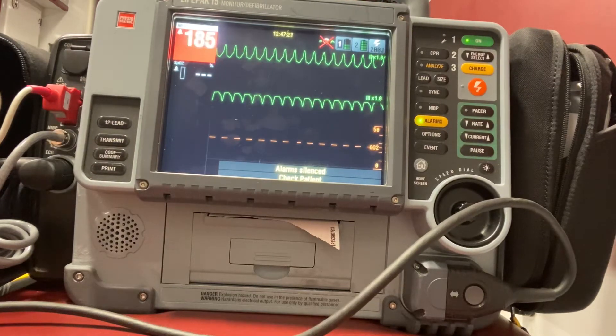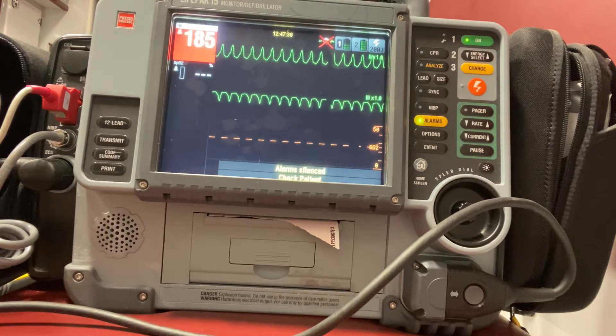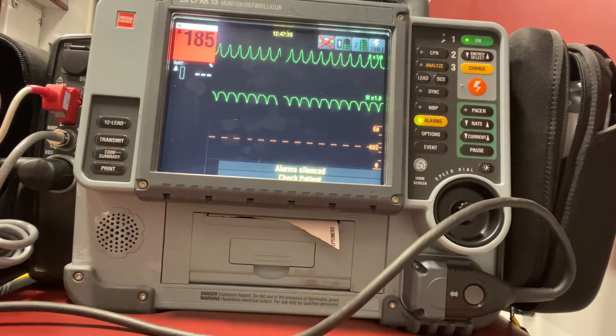For this video we're going to cover synchronized cardioversion. Synchronized cardioversion is when we're delivering a shock to a pulse-producing rhythm and we have to do it at a certain point in the cardiac cycle. That's why we call it synchronized.